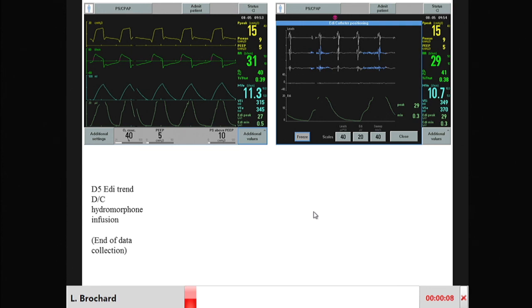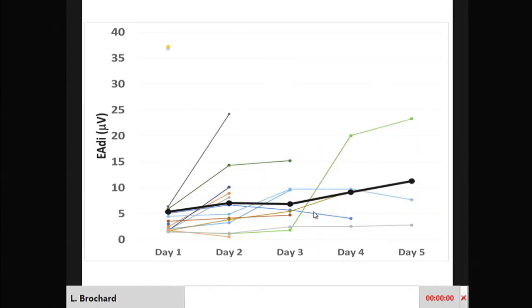So we say, well, we do not worry too much about the first initial hours on mechanical ventilation. Well, it can take 5-6 days very easily, and that will be a patient very likely who will have diaphragm atrophy and weaning difficulties. So we are continuing these studies. This was the result of the first initial 15 patients. We are close to having 80 patients. And thanks to the whole team in our group in Toronto, our research fellow and respiratory therapist, we are close to achieving our goal.